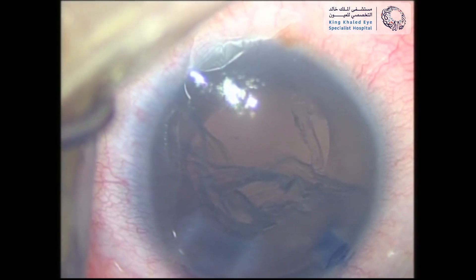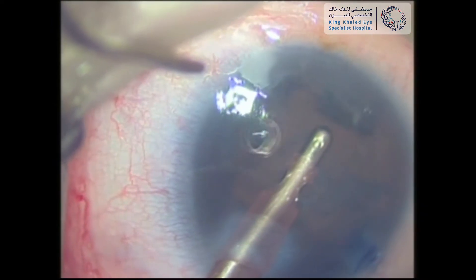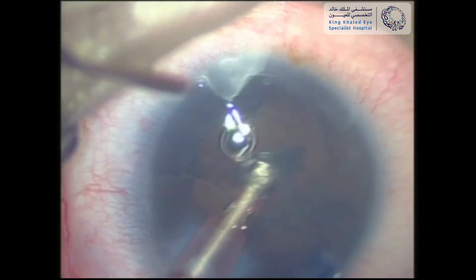Minimal cortical remnants were left behind, and with gentle visco-dissection they were separated from the capsular bag. Aspiration was then easily performed using the I&A probe.